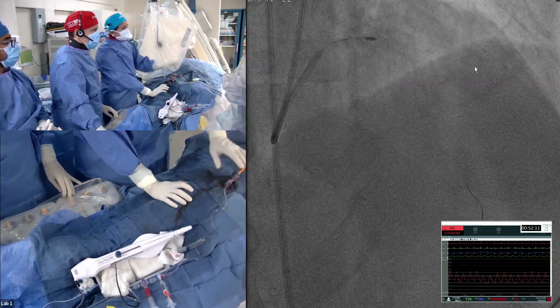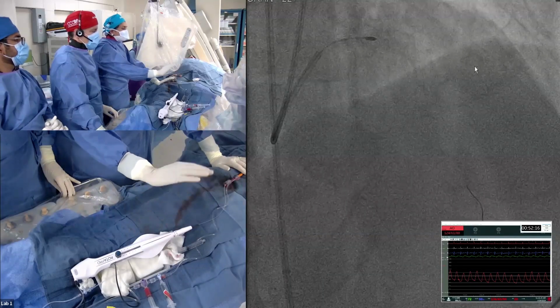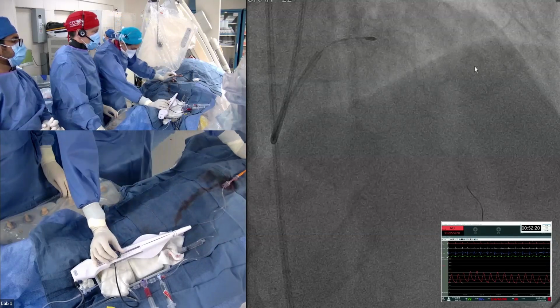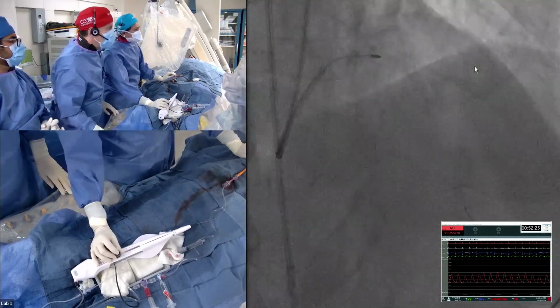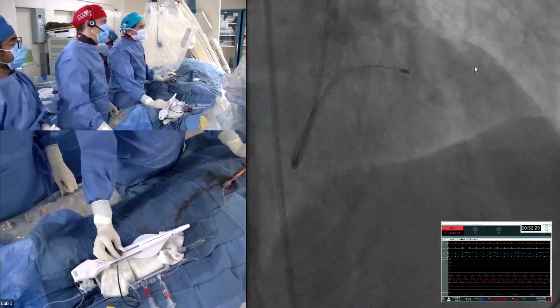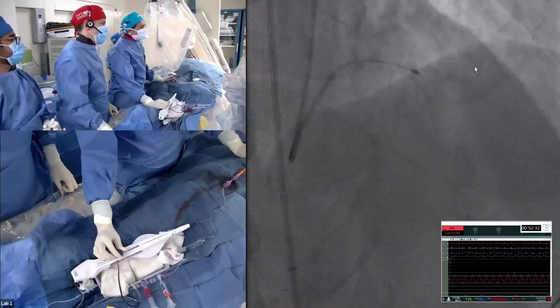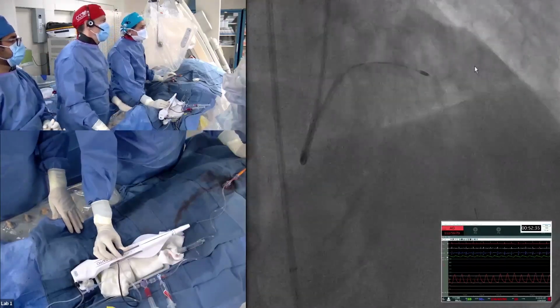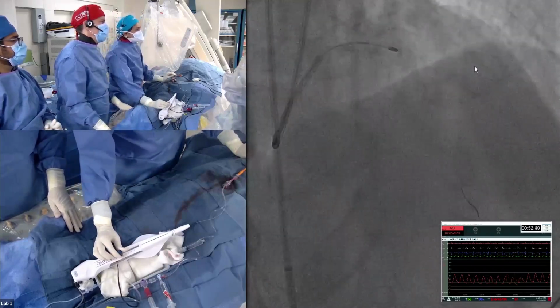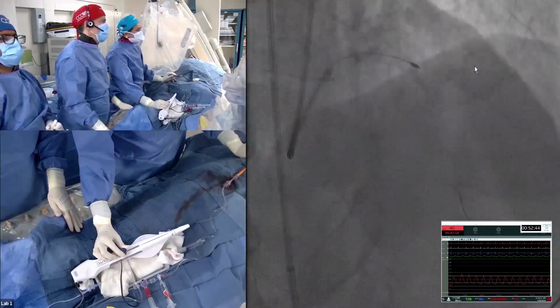The Dynaglide is really important if you have to go to distal RCA, bifurcating PDA, AV continuation, distal LAD, because with your 9 centimeters, you're not going to reach there. Here it is okay, but I just wanted to show you the steps. So we're going to start burring off the Dynaglide with a slow pecking motion. You see that? This is very critical, pecking motion, how my fingers are moving backward, forward. Don't come back too much, because atherectomy only happens with the forward movement, unlike orbital atherectomy, where your atherectomy happens as you're going backward and forward.